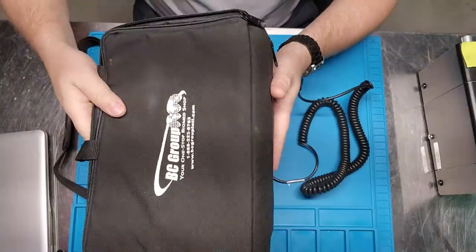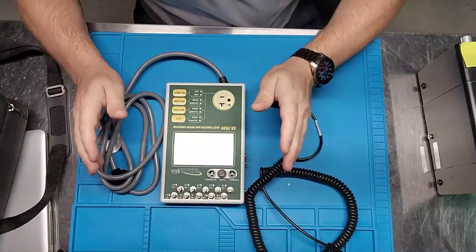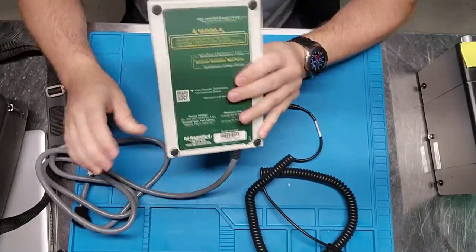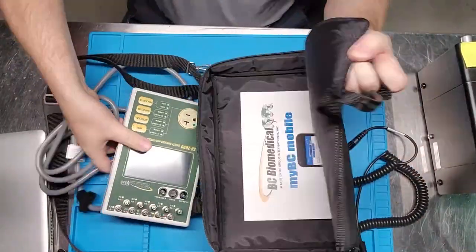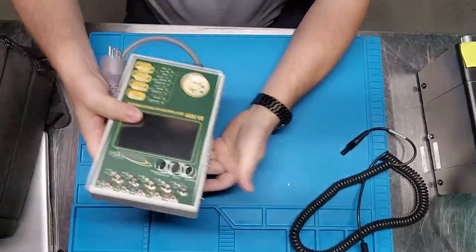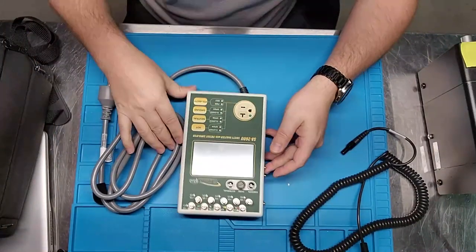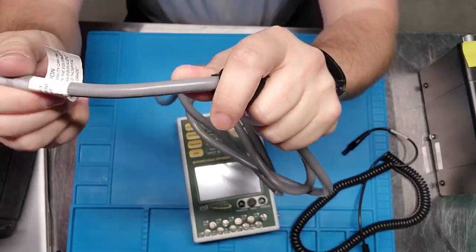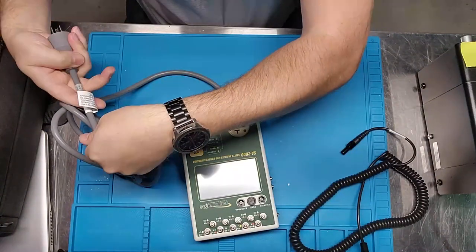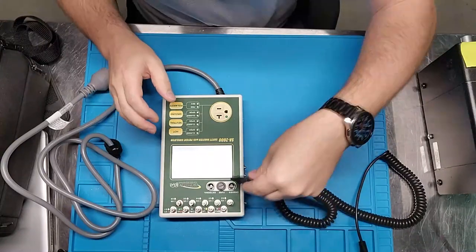First off, it does come in a case, and inside that case you have a rather long, very stretchy test cable and your device, which is hardwired. I love hardwired devices — one really good reason is you can fit the whole thing back in the case with the cord still attached. Many electrosafety analyzers on the market don't allow that. This is not a standard cord either — it's almost 20-amp gauge, about 14 by 3, so pretty hefty cable.